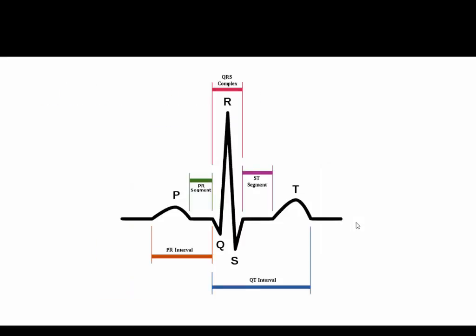So this is what a typical EKG wave looks like. We see repeating patterns of this rhythm, and you have to know the different parts of that. So looking at the first, kind of the easier interpretation, that first bump, the P wave, that just indicates that the atria are depolarizing and getting ready to contract.